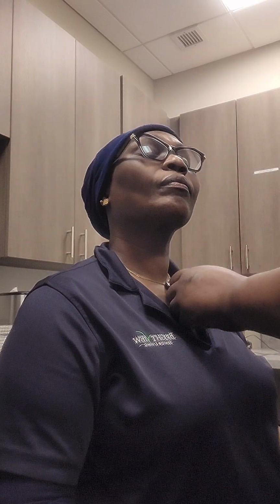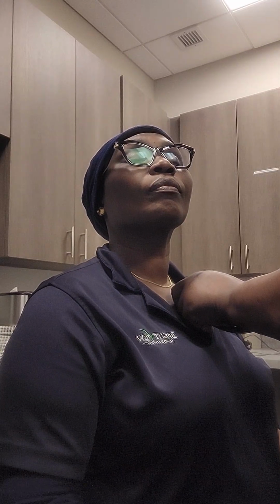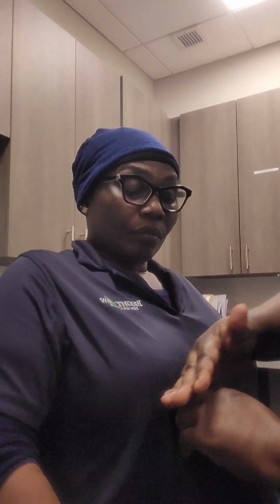So we start again. Listening to the full heart sound from the aortic, pulmonic, Erb's point, tricuspid. Sorry, because it's a female, I have to raise the breast up a little bit. For the mitral.